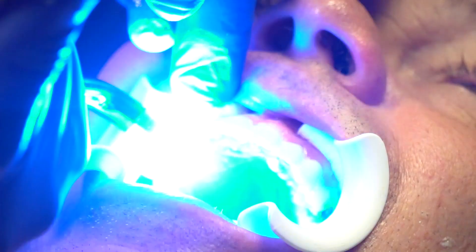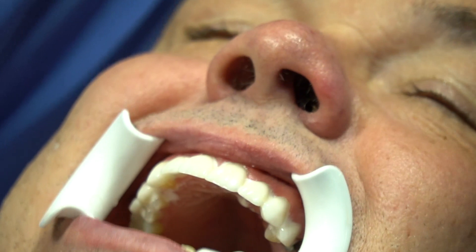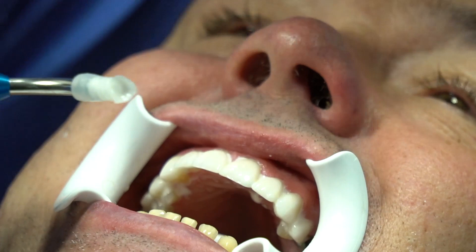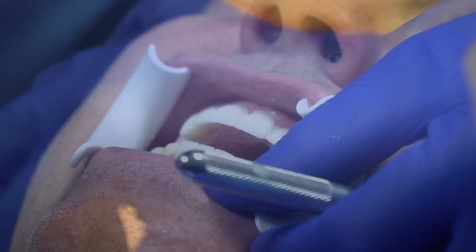We're going to go down below — we haven't dry-fit the lowers yet, so we'll go ahead and put these in quickly. Usually the things that hold up veneers are either you didn't reduce the incisal edge enough and still have a little bond or cement on there, or the embrasure areas. Because these are less of a prep, these don't have as much of a definitive seat.